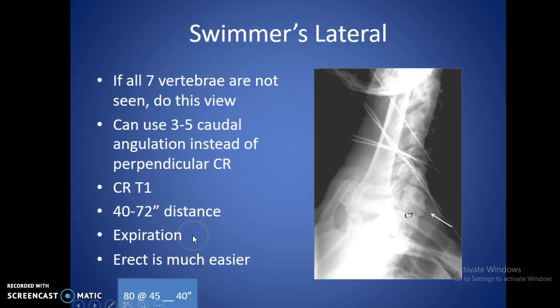It's going to be done on expiration, erect, obviously much easier than to do it on the table, but it can be done effectively on the table, especially when we get into the T-spines.